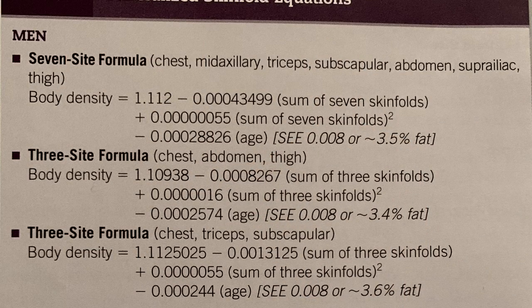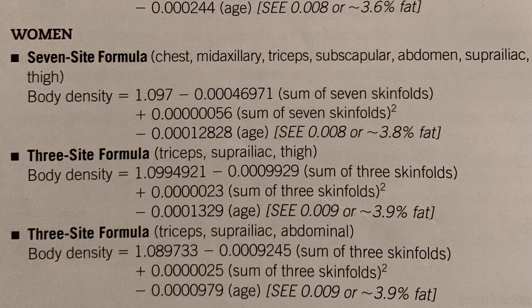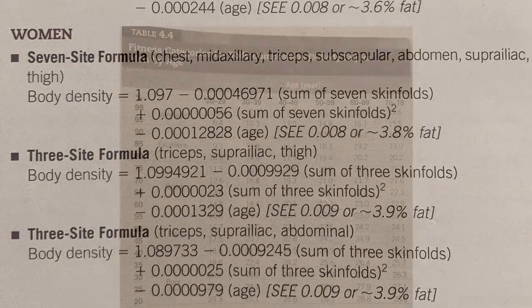Once you have rotated throughout each site and have recorded at least 2 measurements for each one, use the 7-site formula for either men or women, depending on your client, in order to calculate his or her body fat percentage. Go ahead and retest the site if both measurements are not within 1 to 2 millimeters from each other.